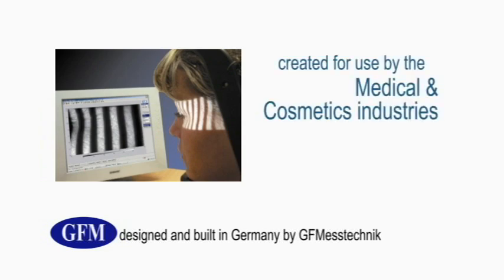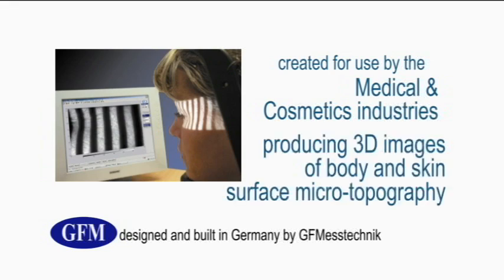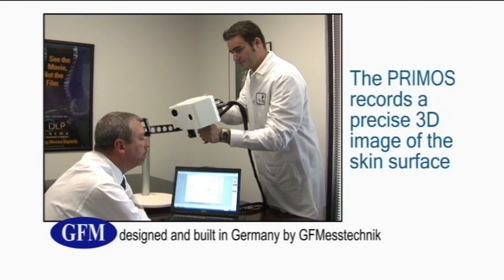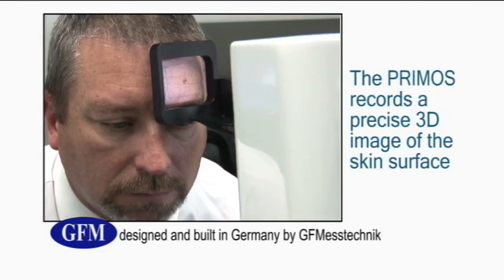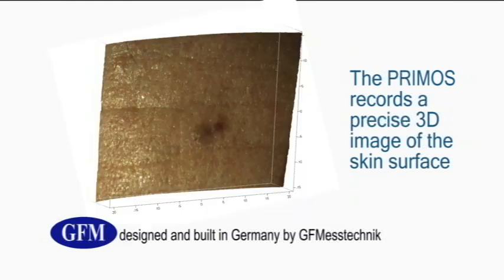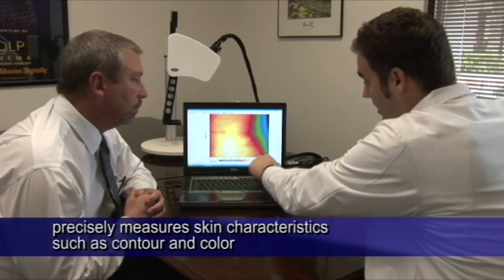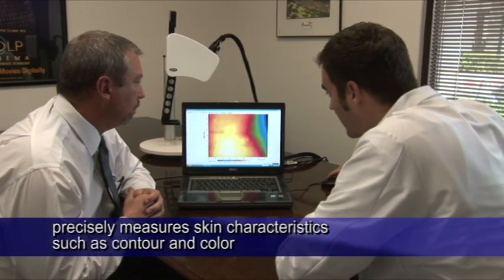The Primos is a device created for the medical and cosmetic industries to produce accurate 3D images of body and skin surface microtopography. The Primos records a precise, detailed, three-dimensional image of the skin surface. The associated software allows physicians and researchers to precisely measure skin characteristics such as contour and color.